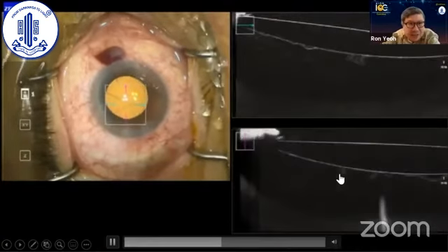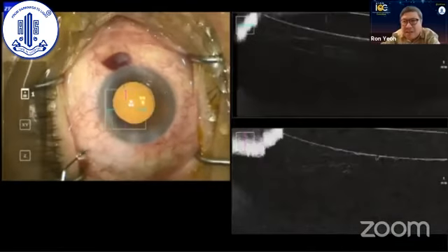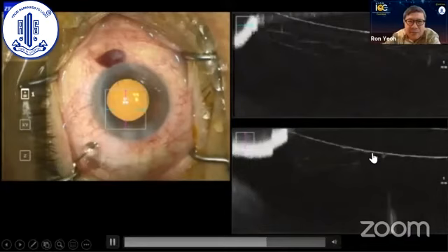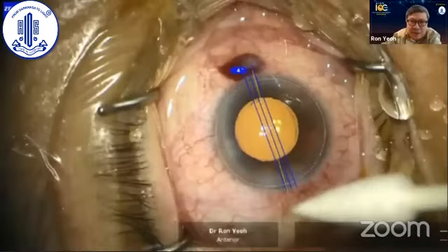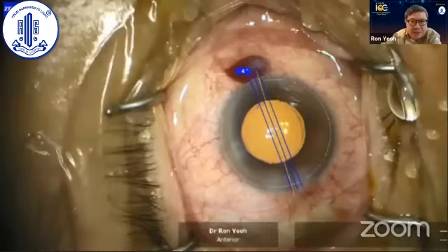And the other thing you see, I'm putting the cannula on the left, and when you press, those crease lines disappear. You can see that those scrolls have been flattened out by the simple maneuver of just pushing down gently on the IOL, and that confirms that this particular diagonal line was not a PC rent, but just a crease line from the IOL haptics.